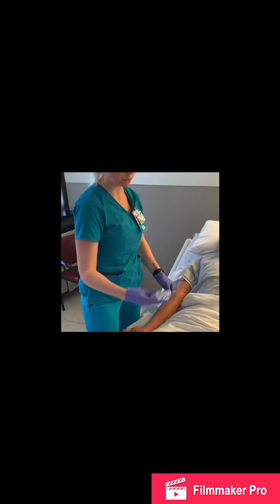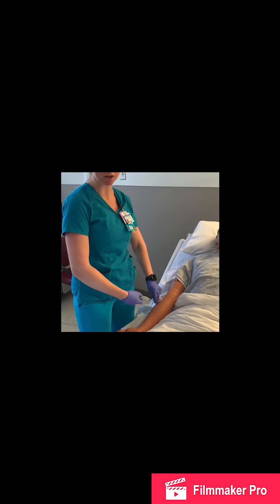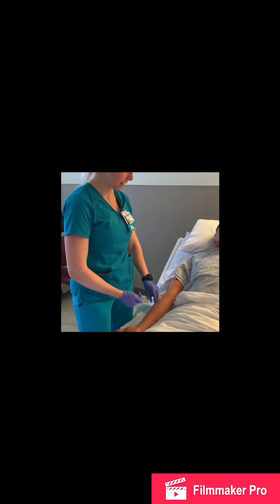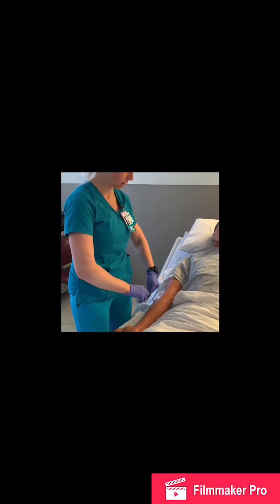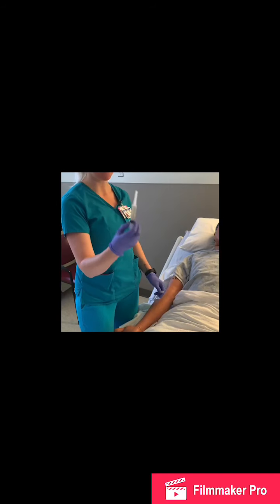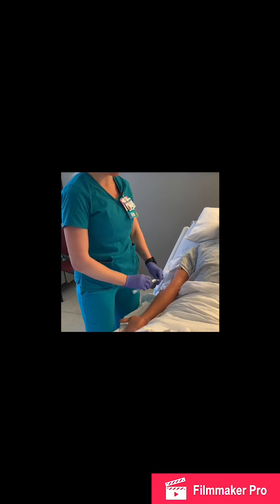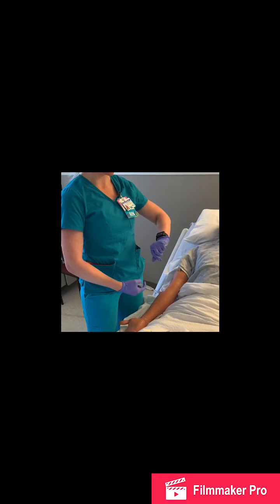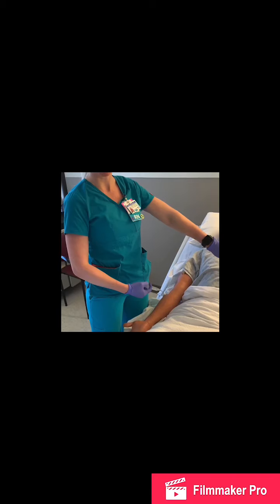I'm going to flush my IV line really quickly here and make sure that I get a good flush and good blood withdrawal on the line. So it's flushing easily, and I'm getting a little bit of flashback. I'm then going to take my labeled antibiotic that I made and hook it up to my injection port here, and then my 5 minutes will start. I'm just going to very slowly push the medication while I'm making sure that I'm watching the time.